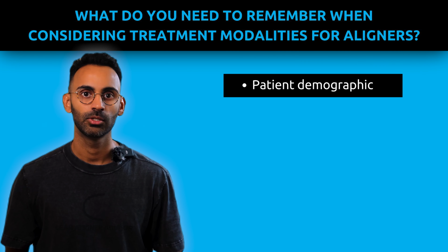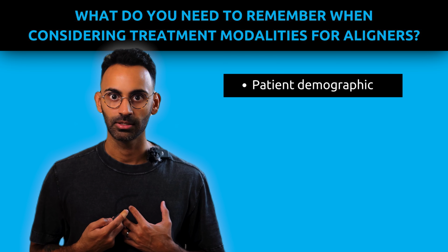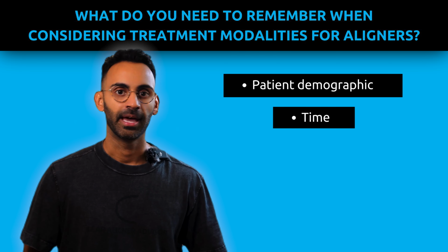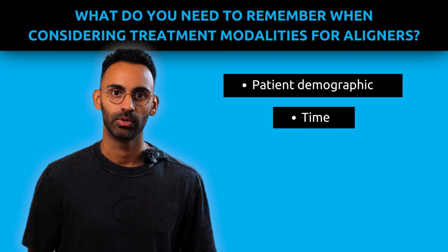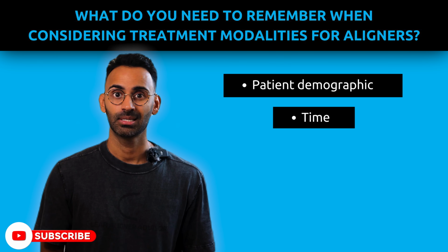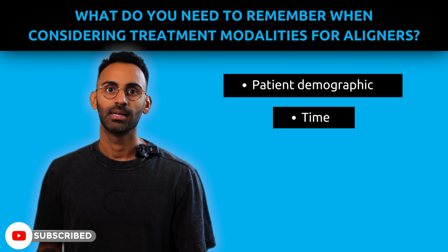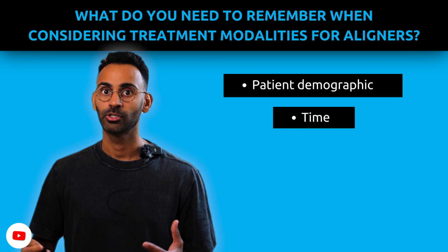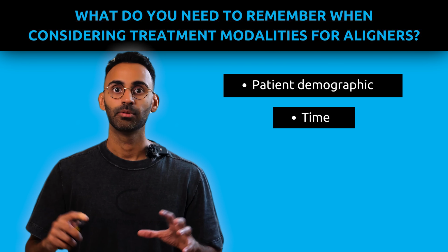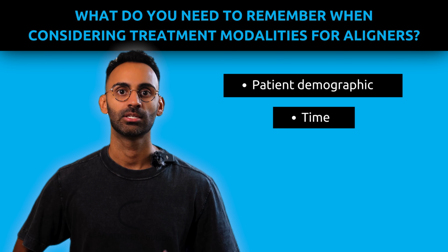Now, what do you need to remember when considering treatment modalities for aligners? First thing to take into account is your patient demographic. Are they adults or are they teenagers? I personally like to treat adults. You want to take into account the time. How long are you going to be spending with this patient? How long do you want the treatment to be? I like to optimize treatment for 6 to 8 months. I don't want to treat patients for over a year because that is not a good experience for them. It's not efficient or profitable for me. And that type of treatment length is best served with an orthodontist. So I don't even take those cases on to begin with.